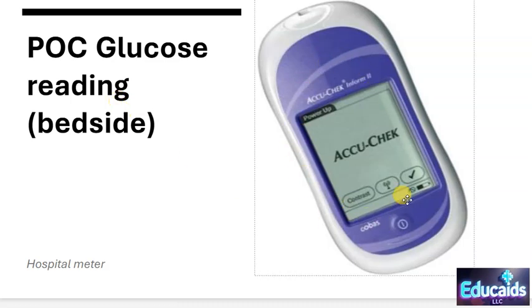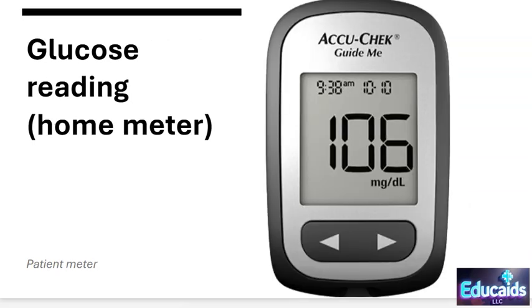This is an example of a hospital meter. I want to point out Accu-Check is a brand. It's a company that makes glucose reading machines. They make them for the hospital and they also make them for home. Hospital meters are generally larger. We do have to input a lot more information into them, such as patient identification, the lot number and expiration date of the strips. It ensures that controls have been run in the past 24 hours, and we'll go over controls a little bit more soon.